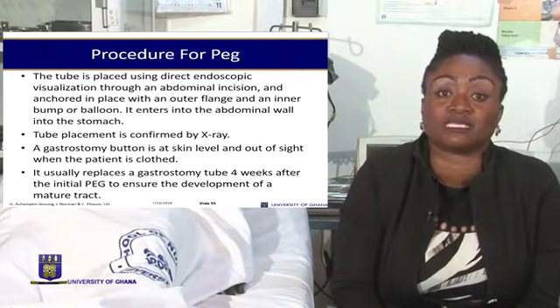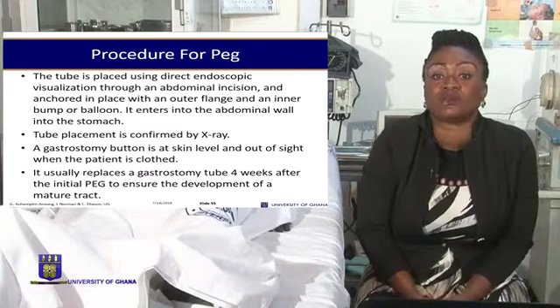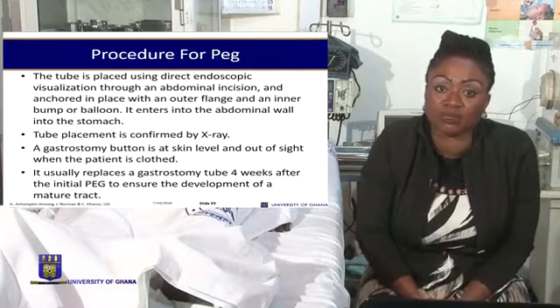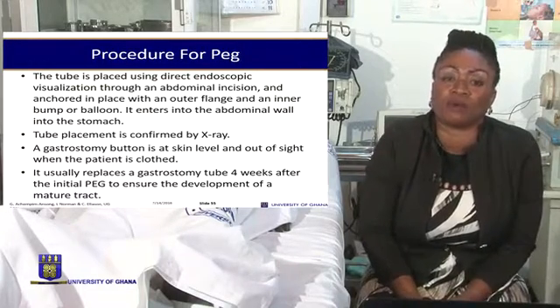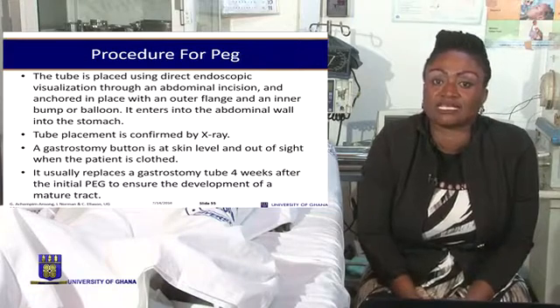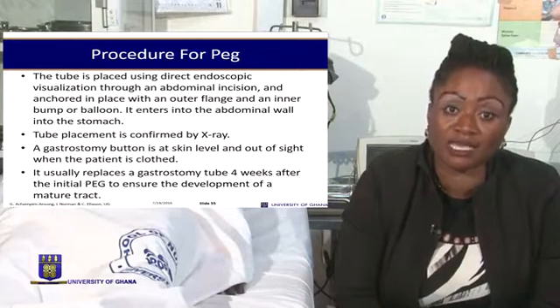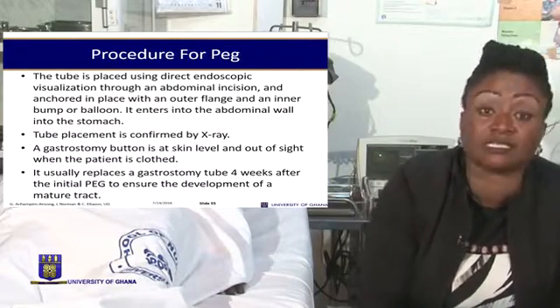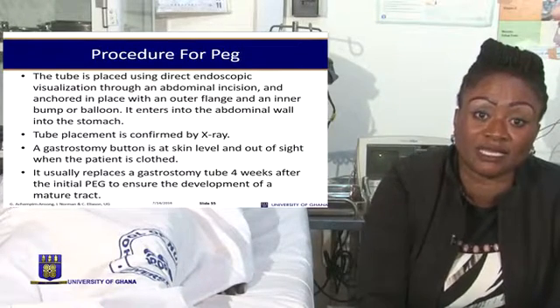The tube is placed using direct endoscopic visualization through an abdominal incision. It is then anchored in place with an outer flange and an inner bump or balloon. It then enters the abdominal wall into the patient's stomach. So it is also invasive, and the incision is made through the abdominal wall to the patient's stomach.